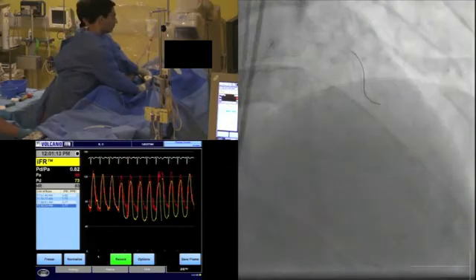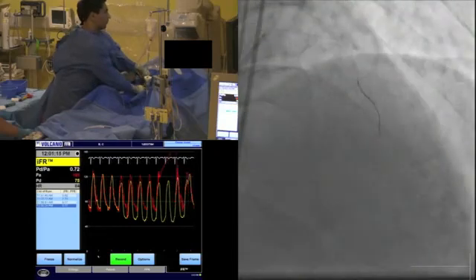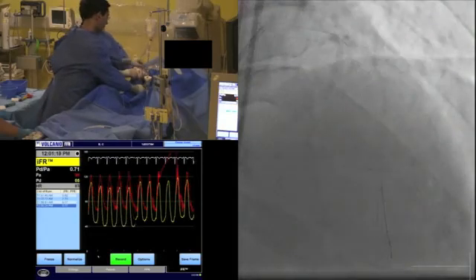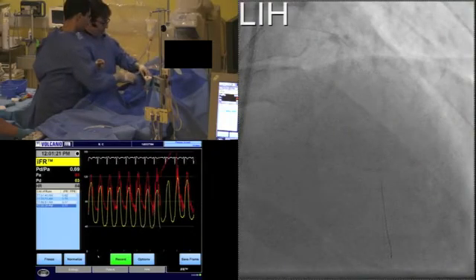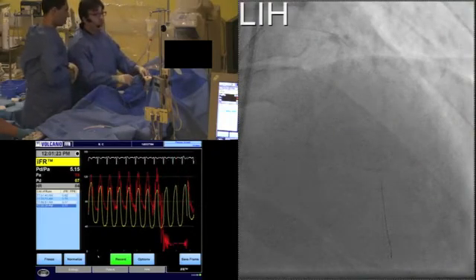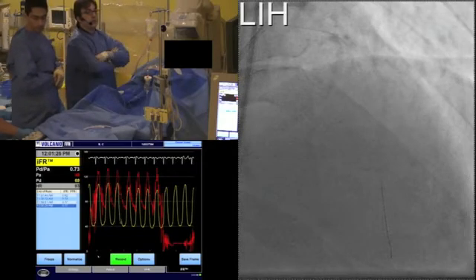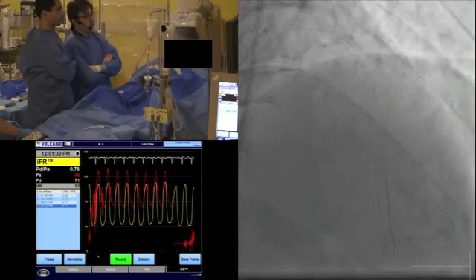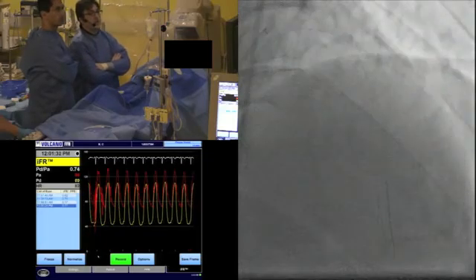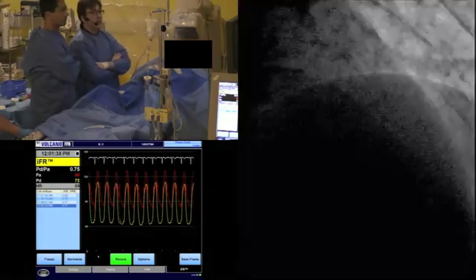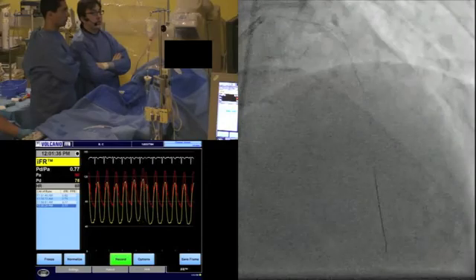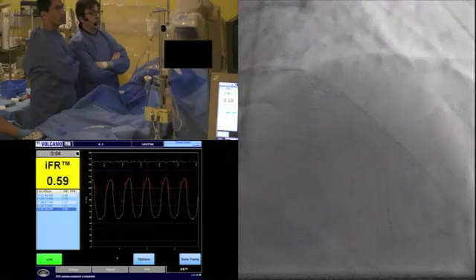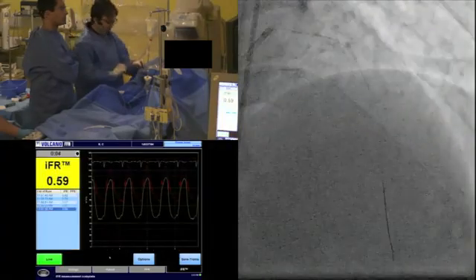Is that in the LAD now? Yeah, I'm in the LAD now. Fluoro record, please, Jules. Thank you. Okay, just documenting the position there. We'll be on that mid-lesion there. Kevin, if we could have another acquisition there with the IFR. So 0.59, highly significant here again.